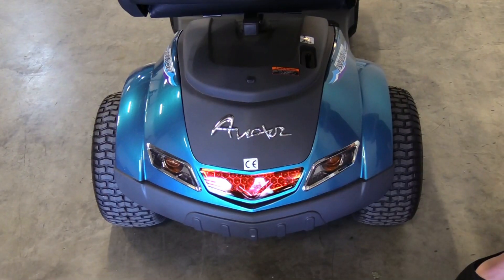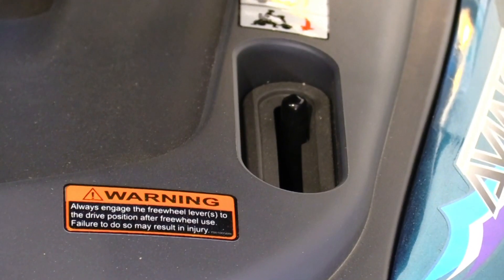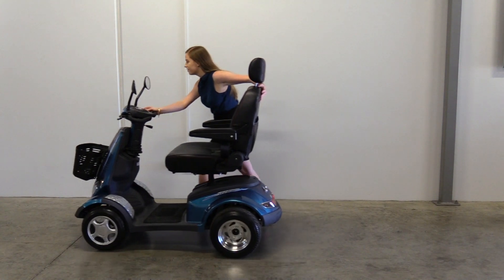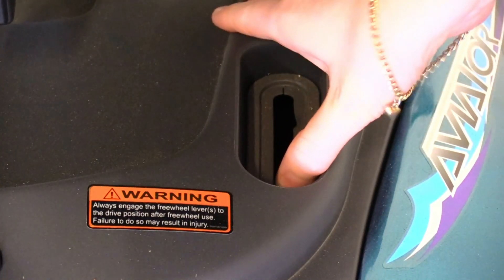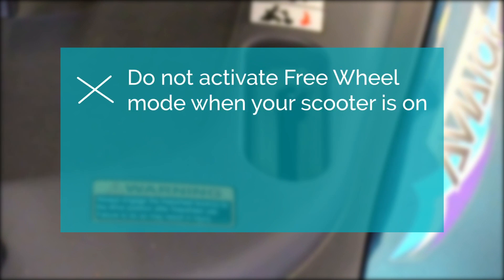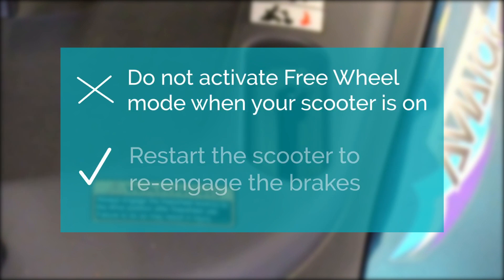To activate freewheel mode on your scooter, locate the black lever at the back of the scooter and push the lever down to activate freewheel mode — this means you'll be able to push your scooter manually. To deactivate it, simply push the lever up again. Do not activate freewheel mode while your scooter is on. If you do, you'll need to switch it off and restart it to re-engage the brakes.